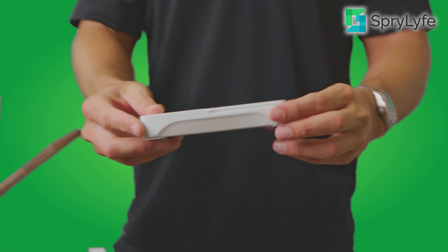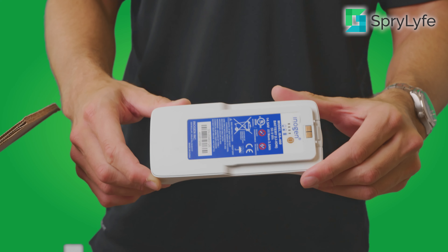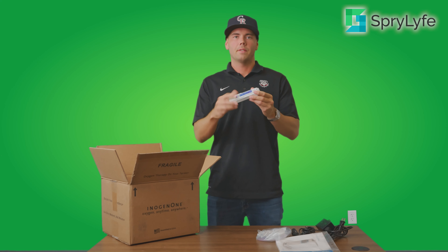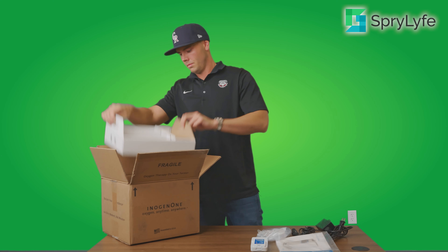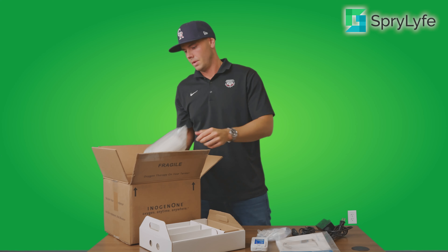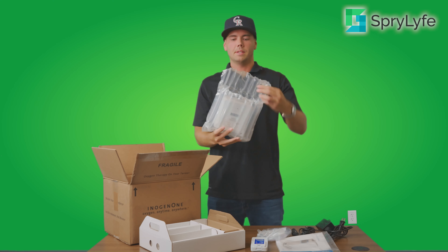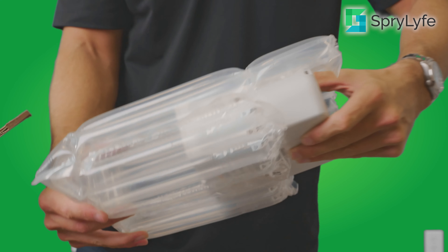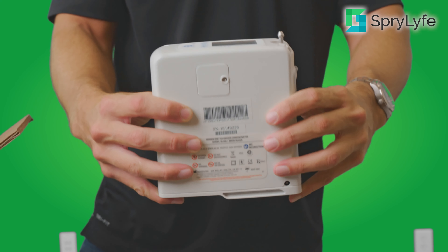Depending on which package you buy, you're going to get either a four-cell battery or an eight-cell battery. This here in my hand is a four-cell battery for your Inogen 1 G4. And finally, you will get the Inogen 1 G4 itself — the machine comes in this nice blown-up bubble packaging, and here you'll have the unit.